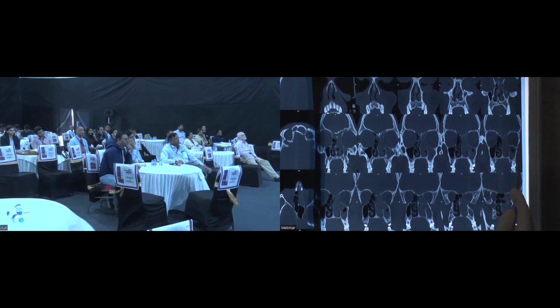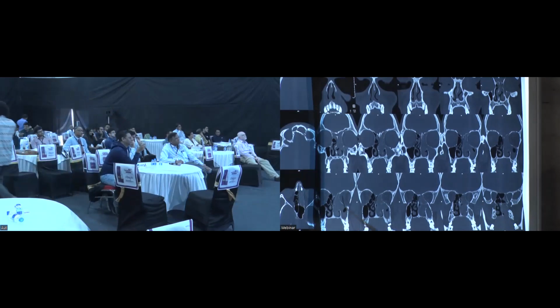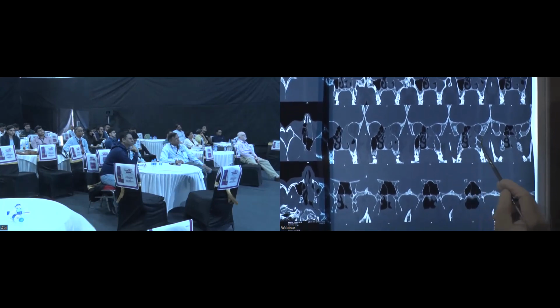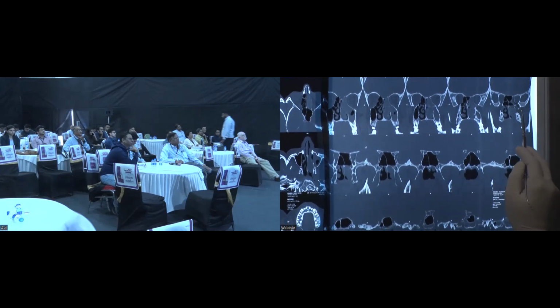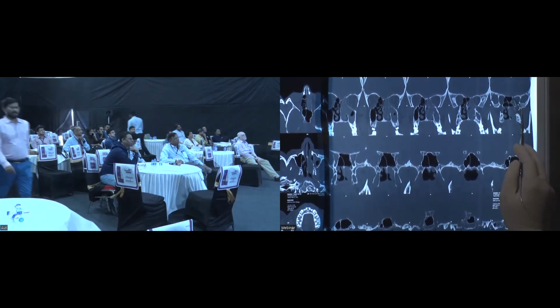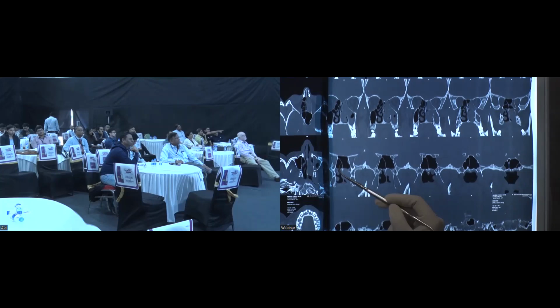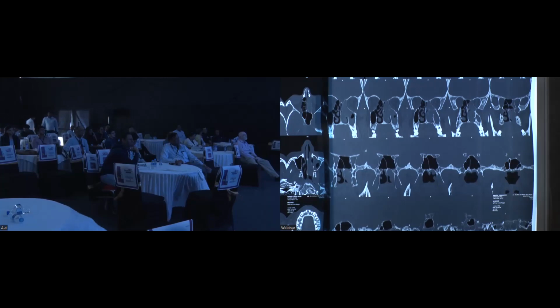And you can see here the beak. In this cut, you can see the anterior ethmoidal artery, which is forming the roof of the ethmoid. As you go backwards, you can see that the entire left side is involved. As you go further, even the posterior ethmoids are involved, some area of sphenoid, and you have probably a situation like Onodi. But posterior cells are still free. If you go still backwards, the sphenoid is nearly free. So without much discussion, we will go and start the case.